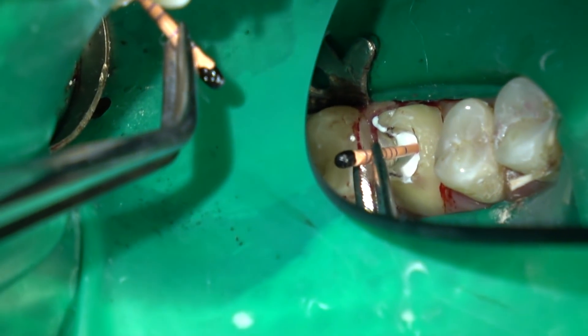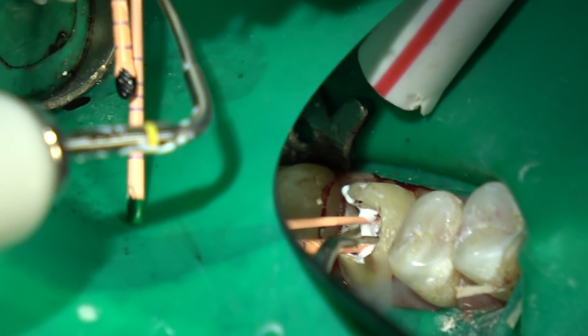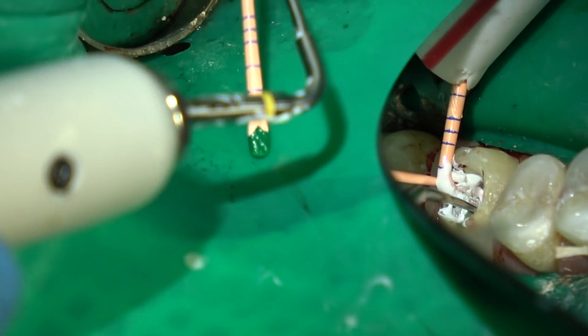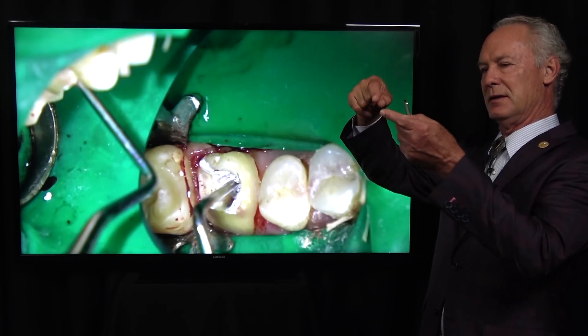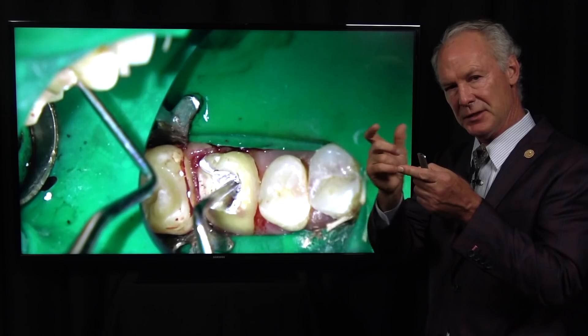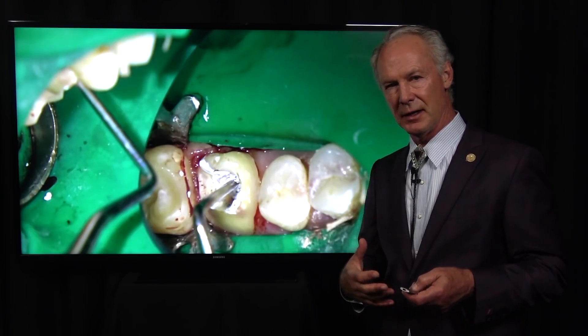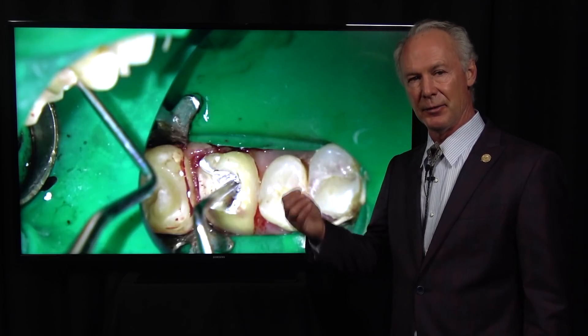Here's the third canal and the MB2. Honestly, if I get the MB2 more than just a little niblet — more than 30% of the time — that's a lot. Most of the time the MB2 is not consequential, and if it is there it joins the mesial buccal canal very quickly. Sometimes I'll just inject sealer under pressure into the MB2 canal. My endodontic success rate over the last 20 to 25 years is 100% — I can't ever remember losing a tooth that I've performed endodontics on with this technique.